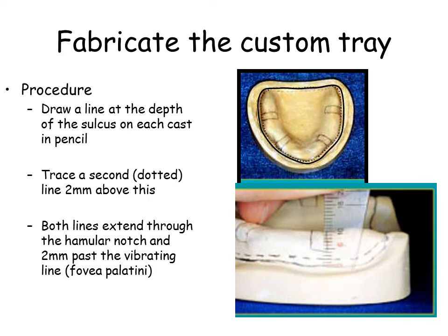Using the maxillary cast, draw a solid line in the depth of the sulcus. Trace a dotted line approximately 2mm above the solid line. Both lines extend through the hamular notch and 2mm beyond the vibrating line as seen in the diagram.